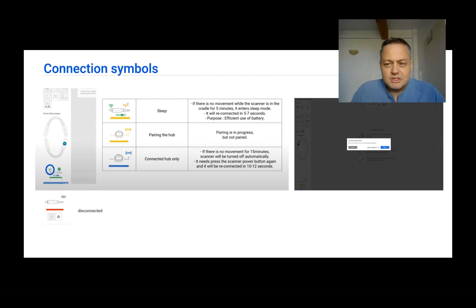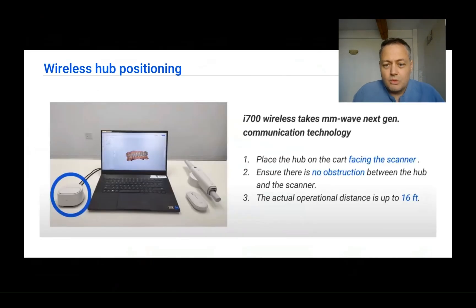Watch these symbols on the lower left to understand what is happening with your device. For the i700 wireless, it uses a new antenna — the actual hub — which must face the scanner with a straight part and no obstructions. Try to place the antenna toward the chair and patient to maximize scanning potential and avoid interruptions.